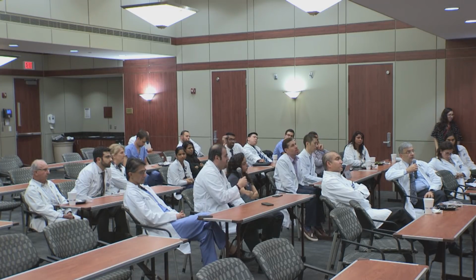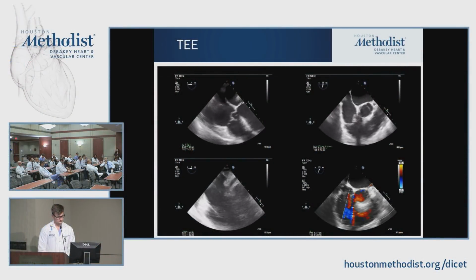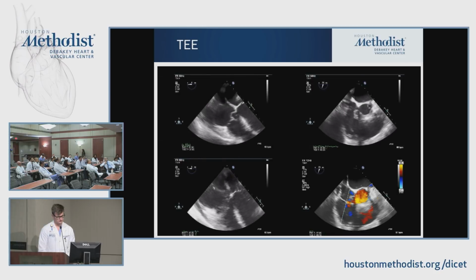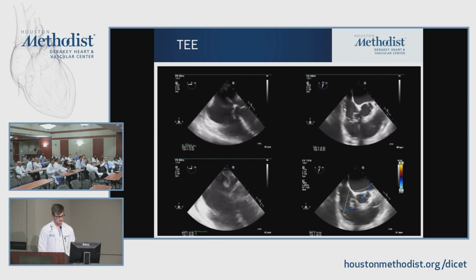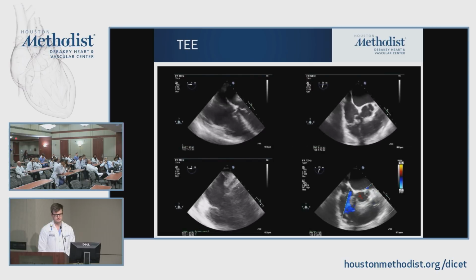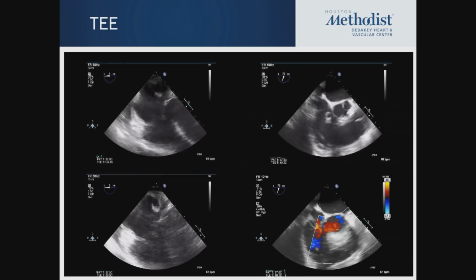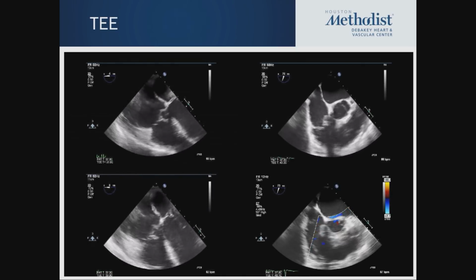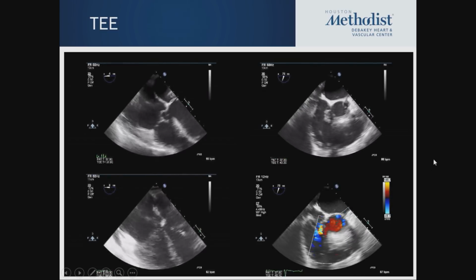The interesting thing on your left lower screen, right? This is a cut close to the base of the heart. And why do I know that? Because I see the coronary sinus, right? So it is not close to the membranous septum anymore. We're down close to the crux of the heart, and we're still seeing the abnormality, right? So it could still be affecting and eating up through the tricuspid valve. I just don't know at this stage of the game.